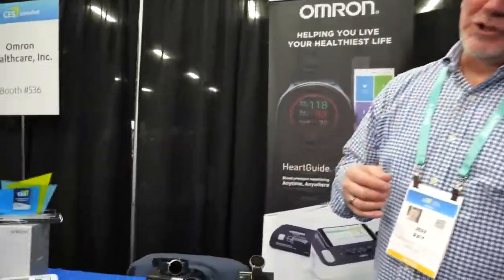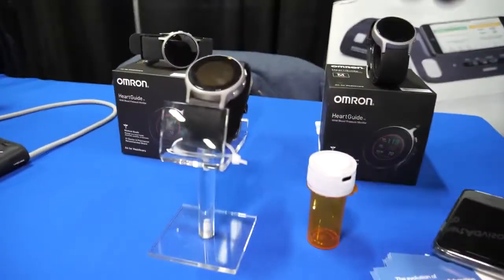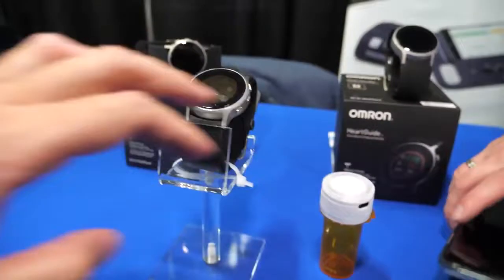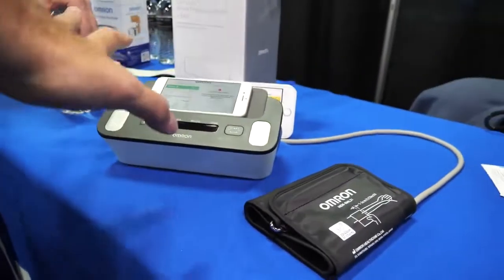With both the HeartGuide and the pill cap together, the doctor can now see whether the prescribed medication is actually producing the desired results. You just need these two devices — you don't necessarily need the larger separate unit, which is a different, bigger product.